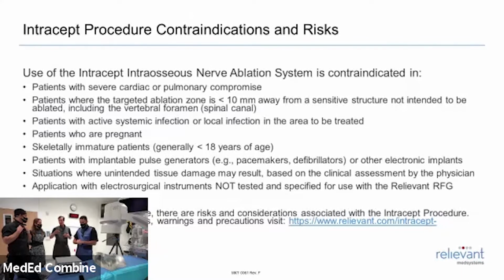So this appears to be, unlike other radio frequency ablation procedures, permanent. The nerve does not grow back. That's one thing I tell my patients. They ask me, well, when do I have to come in and do this again? Because a lot of people have heard of ablation. That's right. That's a different type of ablation they're most likely talking about.